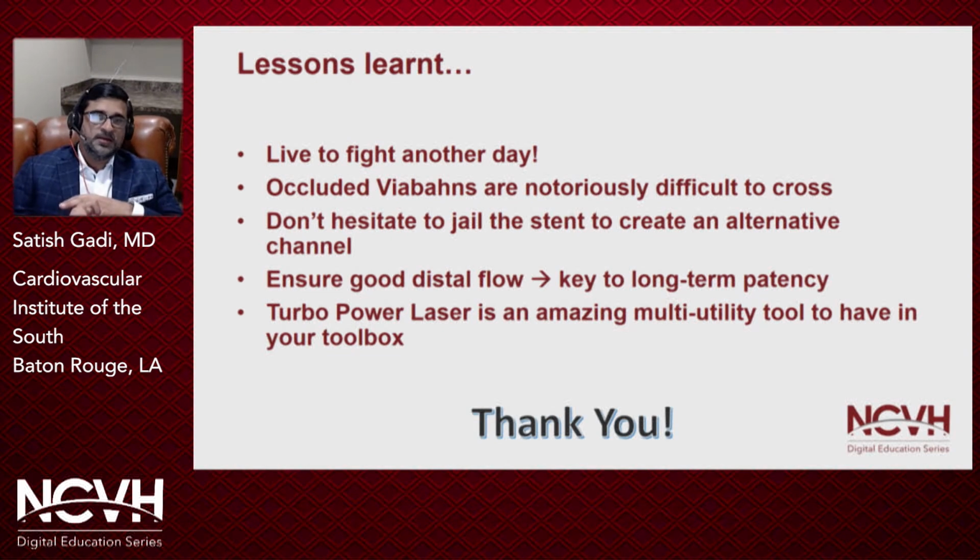Number two that I learned is occluded Viabahns are notoriously difficult to cross. The question is, should we even try to cross them? In this case, we just decided to jail this Viabahn and place stents to create an alternative channel. In fact, we were actually intraluminal. So I'm not even sure if the Viabahn itself was intraluminal. So that's something to be considered.